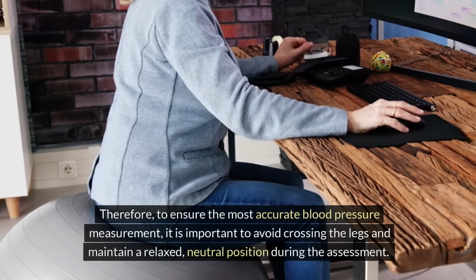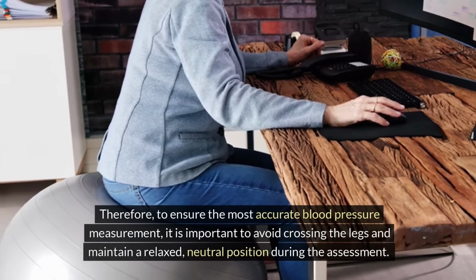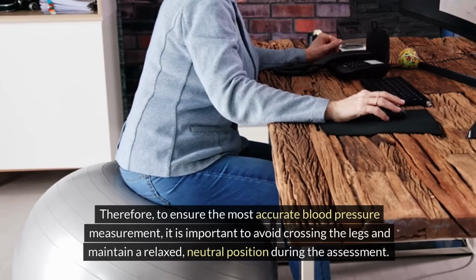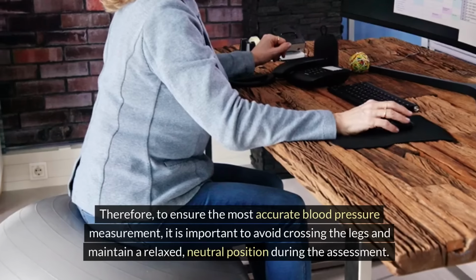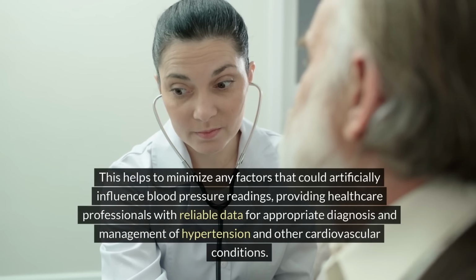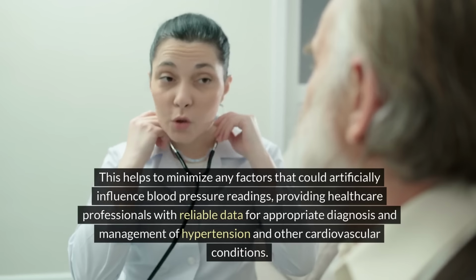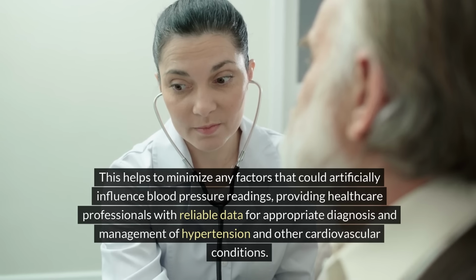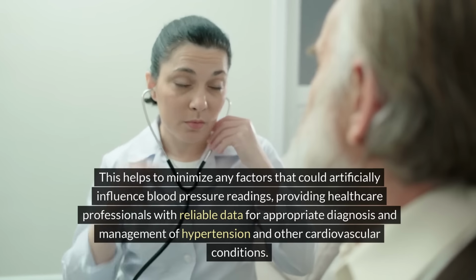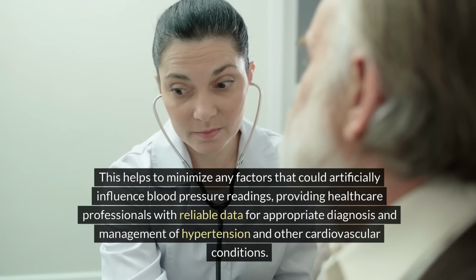Therefore, to ensure the most accurate blood pressure measurement, it is important to avoid crossing the legs and maintain a relaxed, neutral position during the assessment. This helps to minimize any factors that could artificially influence blood pressure readings, providing healthcare professionals with reliable data for appropriate diagnosis and management of hypertension and other cardiovascular conditions.